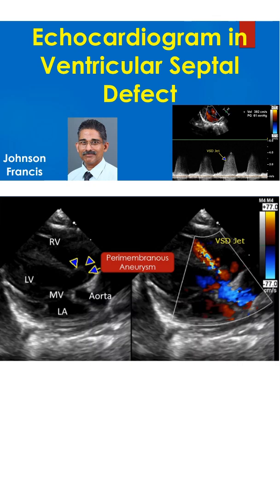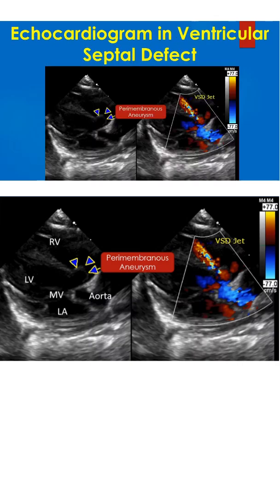Discussion on echocardiogram in ventricular septal defect. Parasternal long axis view shows the subaortic perimembranous ventricular septal aneurysm, marked by arrows. There is a small ventricular septal defect at the apex of the aneurysm, which is not very clear in the 2D image.